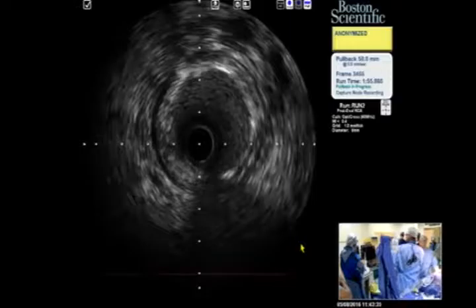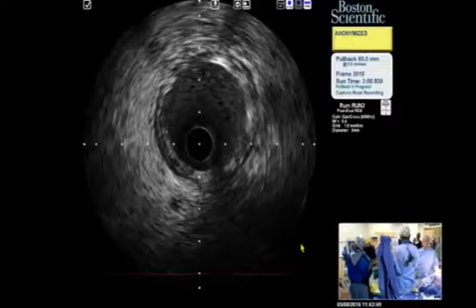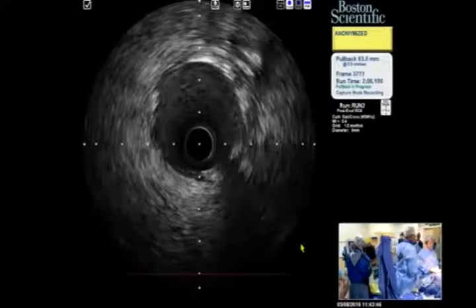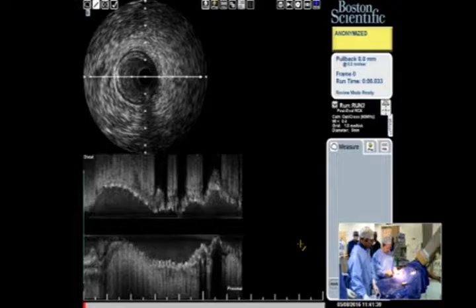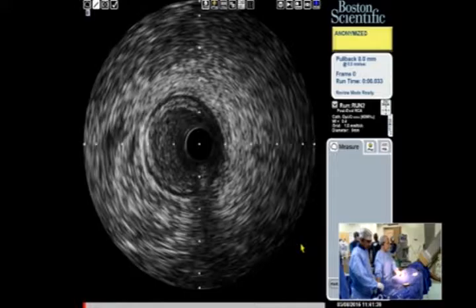Proximally, maybe we have to do a little bit proximally. No, isn't it enough? Yeah, the constrained part a bit, I think we have to do. Keep that balloon ready, sister. 3.5, put that in. The proximal is fine. So only that constrained part, a little bit, we had to do. But this was before. Yeah, we have to take a picture. Most probably that is the part we had. Okay.